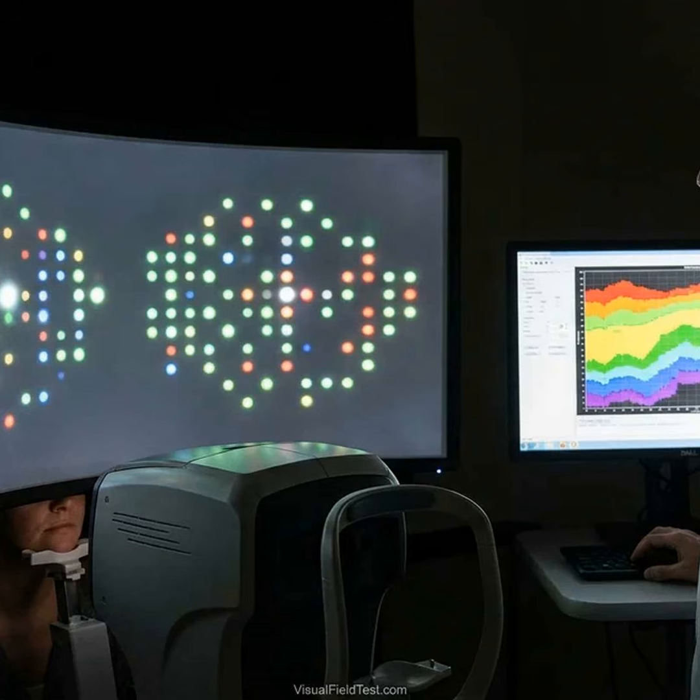In the prospective matrix FDT study, new visual field defects appeared on FDT slightly more often than on SAP, 8.0% versus 6.2% of eyes, over 3.4 years. The authors noted that FDT did detect some defects not yet seen on SAP. In other words, FDT caught a few cases a bit earlier. On the other hand, long-term predictive studies of frequency doubling perimetry are limited. One small analysis suggested that rapid worsening on FDT perimetry was associated with faster SAP decline, but this is not yet definitive.